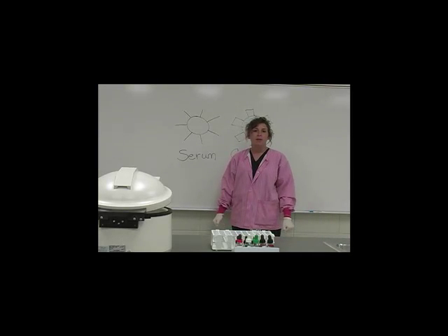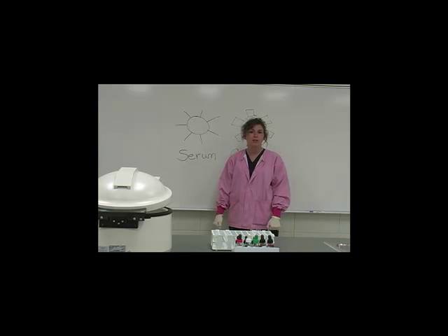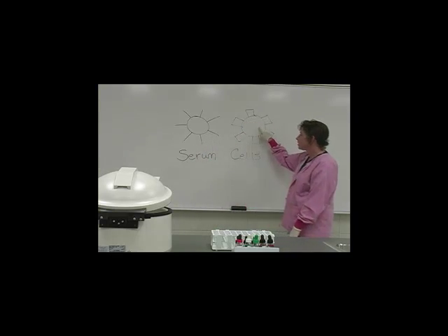Today we're going to talk about ABO screening. Everyone is curious to know what their blood type is. And in order to know this and be able to understand the rest of the presentation, it's important for you to understand two basic concepts, and that is going to be the antibody and the antigen.